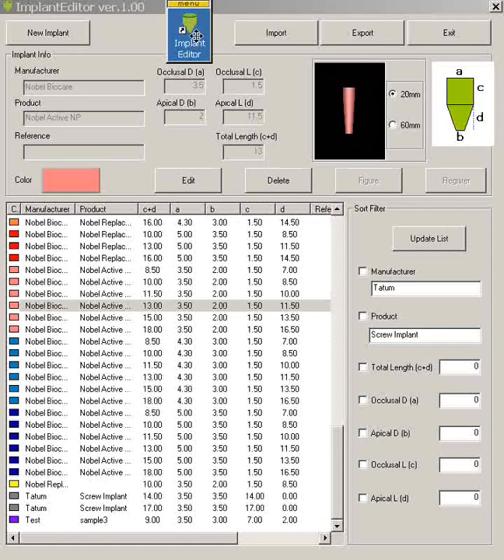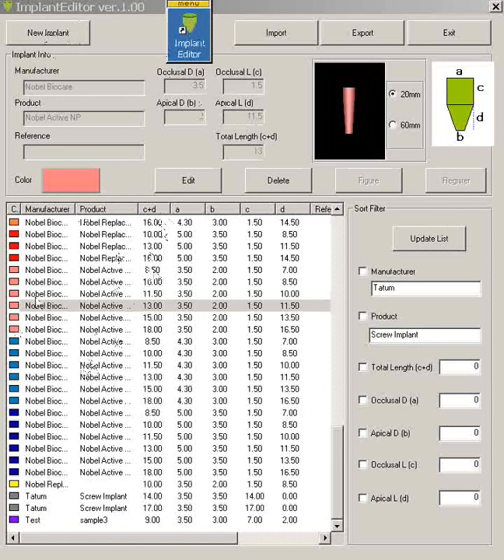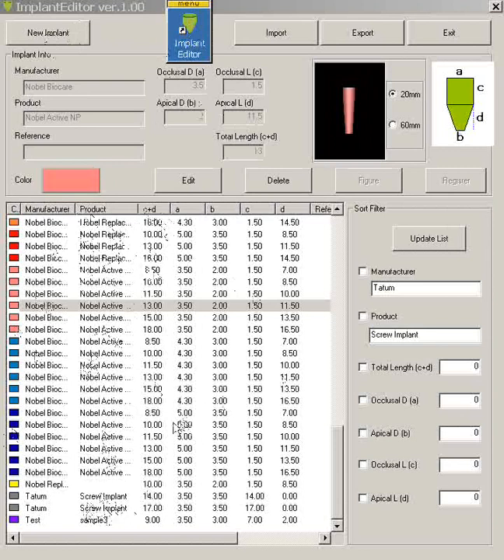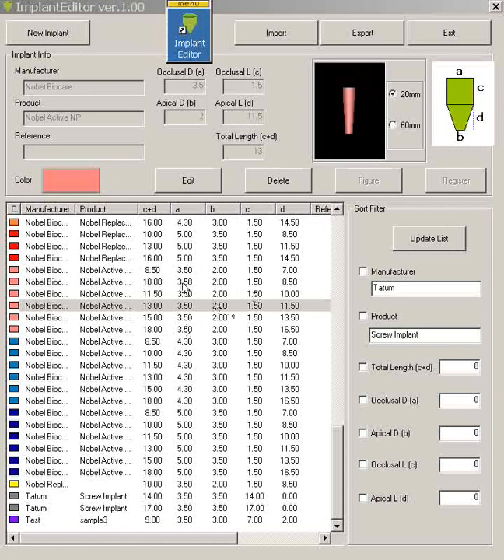So when you click this icon you're going to get the implant editor. And in the implant editor we can register shapes. Here you'll see some shapes from Nobel have already been registered here. And we can delete these if we don't use these or we can add as we've done down here. So you have that ability to add or remove in your implant library.